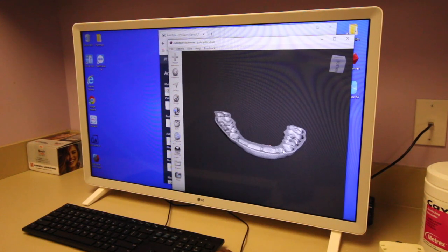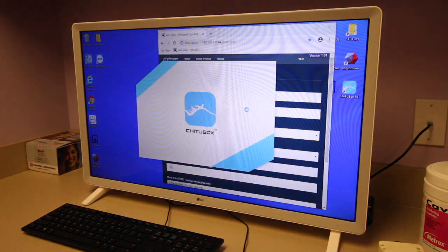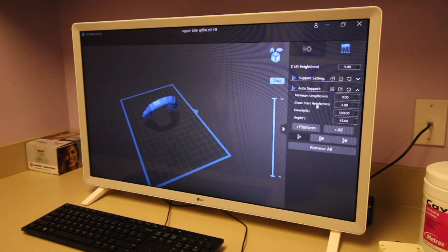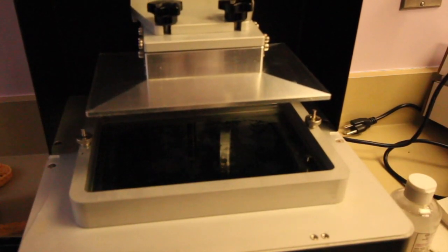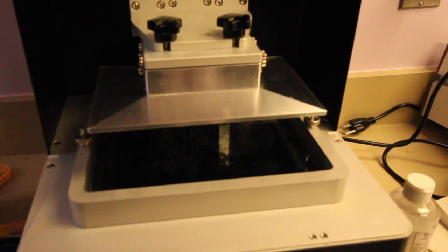And then we have designed an occlusal splint in Mesh Mixer. And then we're going to use Chitubox to add supports to this. Okay, and it's ready to print. So we're using ortho-clear resin, and the platform is going to lower and it's going to cure in layers here. And I'll show you the finished product.